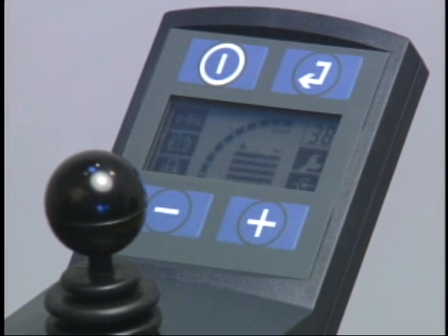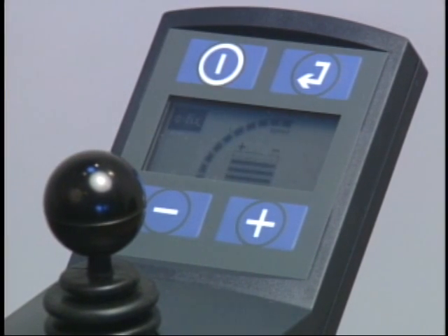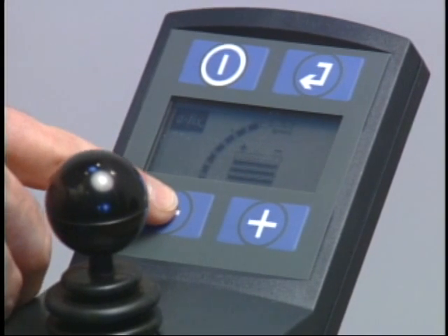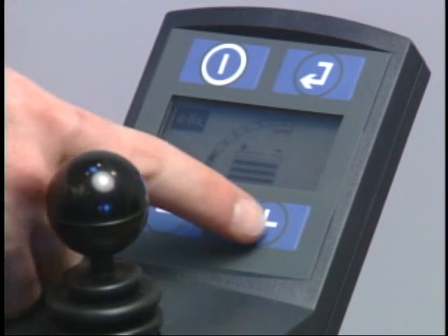The programmable backlit LCD display joystick shows battery charge and speed adjustment for easy viewing. Driving preferences such as acceleration, deceleration, and sensitivity of the E-Fix are easily adjustable with the touch of a button.